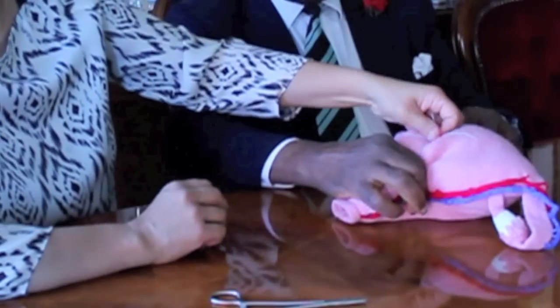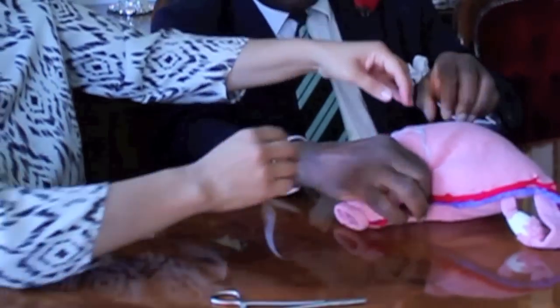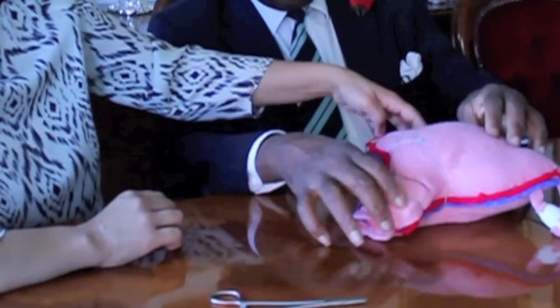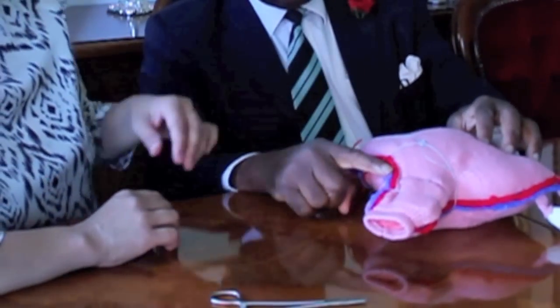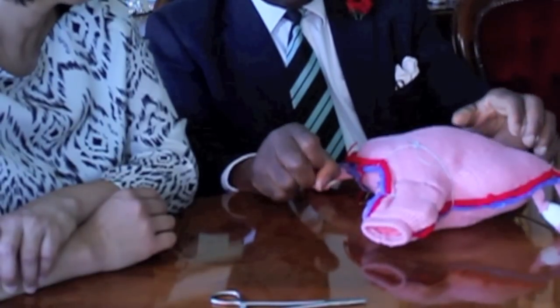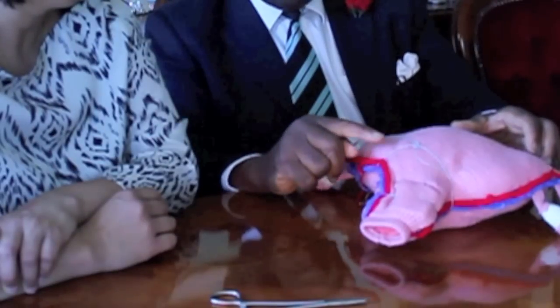By double lock technique. You now have compression as well as devascularization of the area, as demonstrated here.